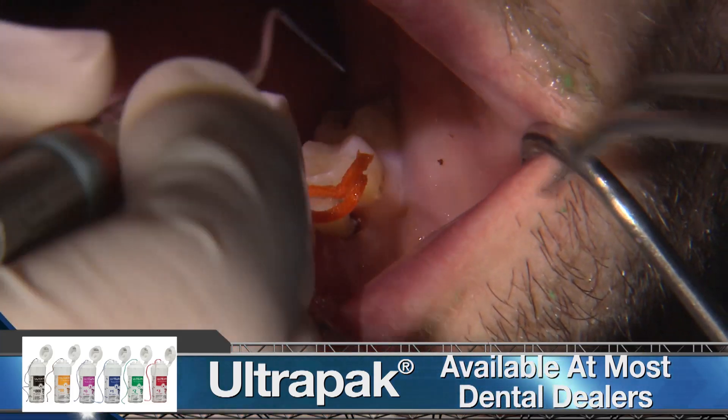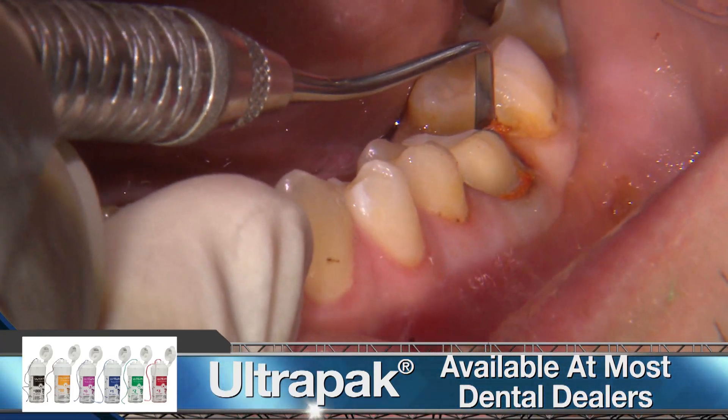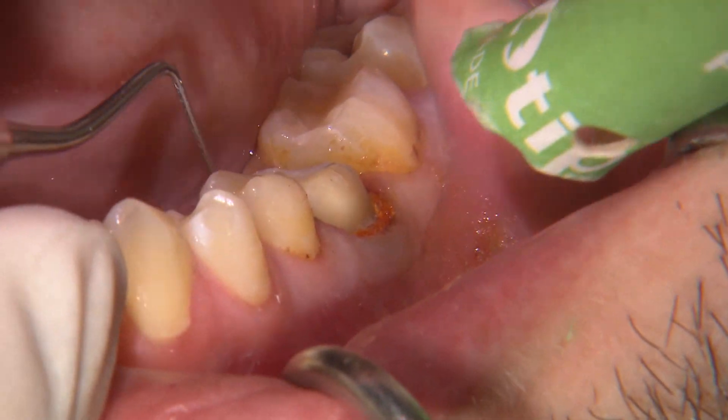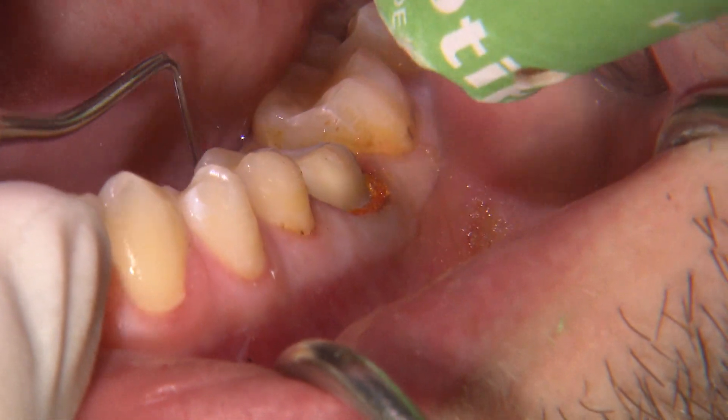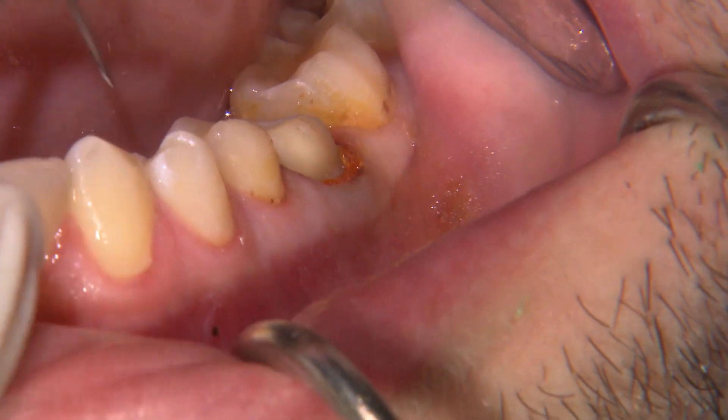Since all the margins are subgingival, I'm placing a single size 2 cord into the sulcus to retract the soft tissue for our optical impression. I remove the cord after five minutes and then isolate and dry the area for the impression.